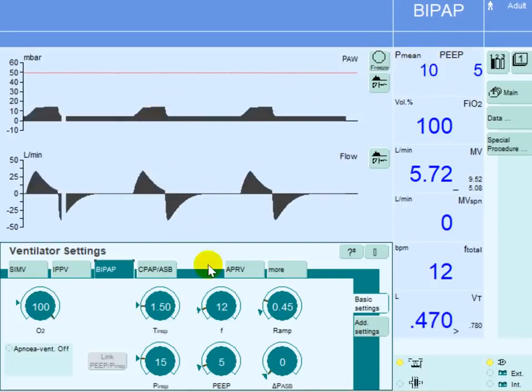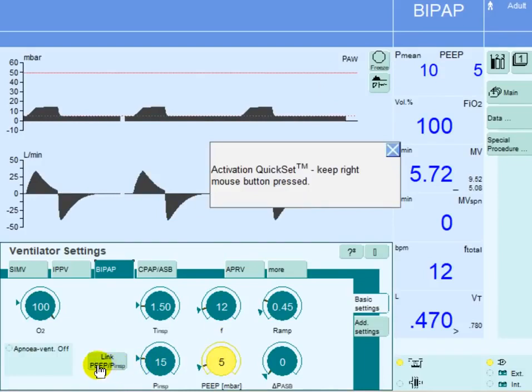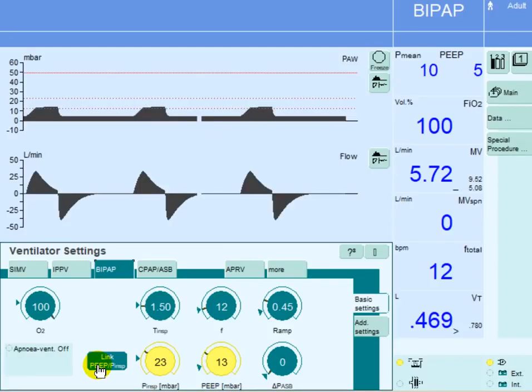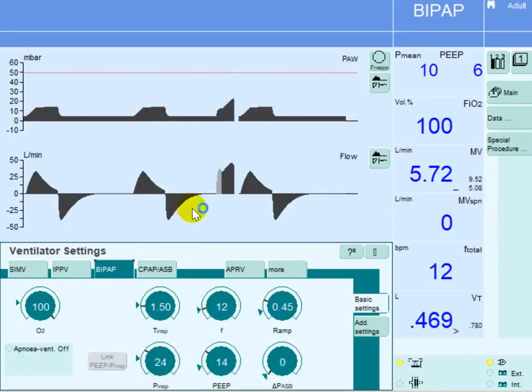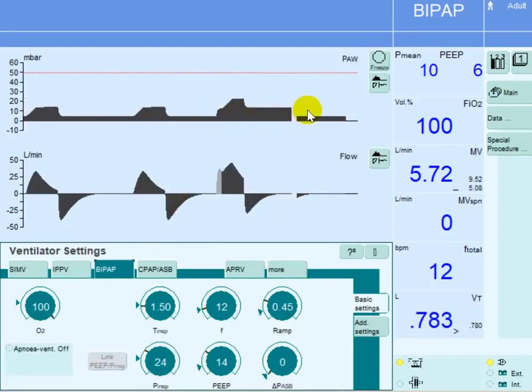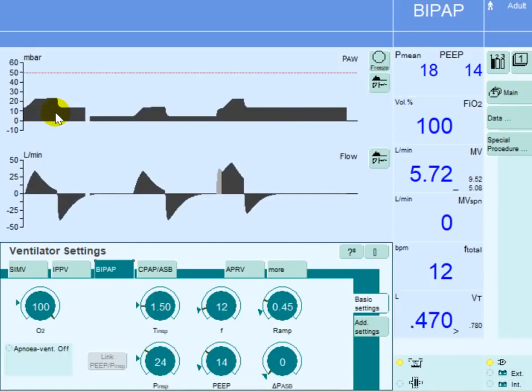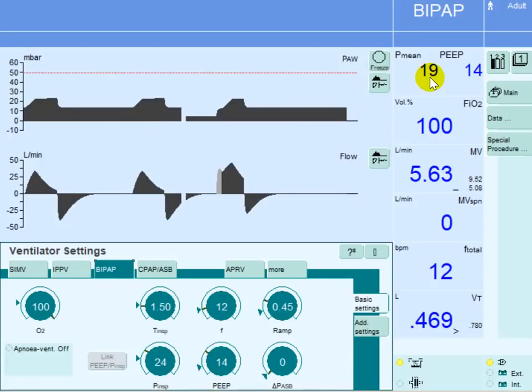We can increase the mean airway pressure by going up on the PEEP. If we go up on the PEEP all the way to 14, we will increase that pressure in both expiration and inspiration, so it will have a remarkable effect on the mean airway pressure. You can notice that the mean airway pressure increased from 10 all the way to 19.